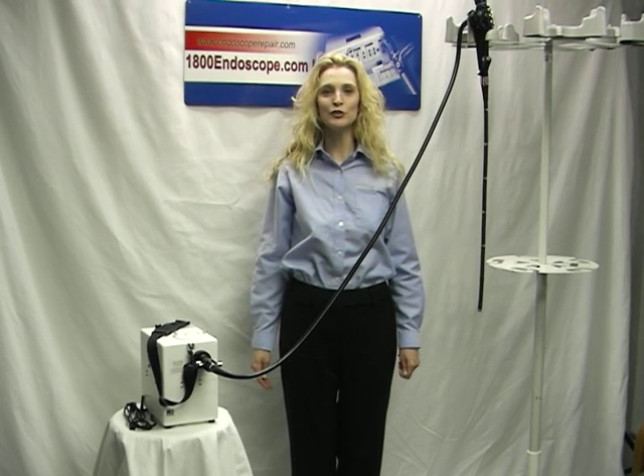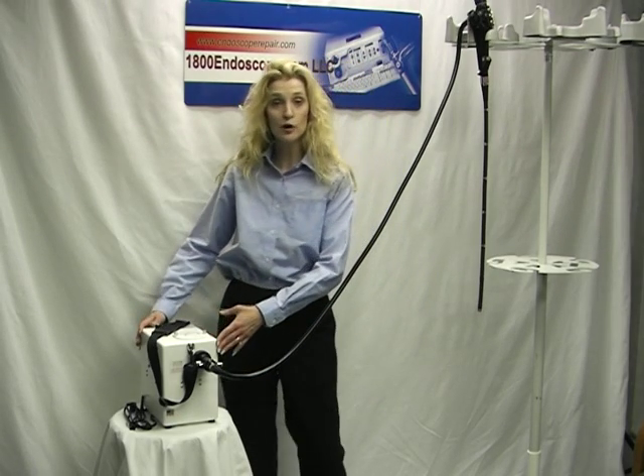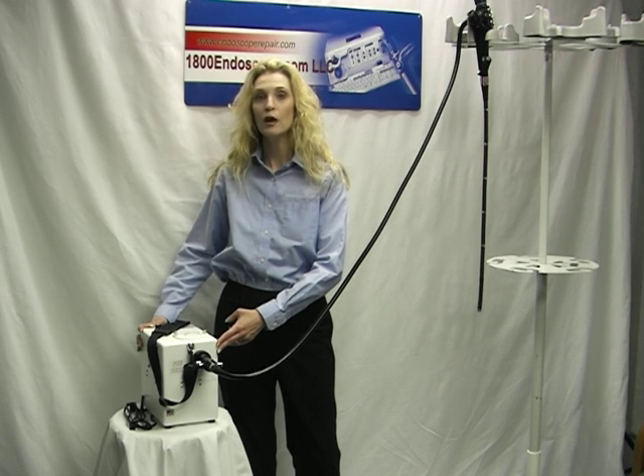Welcome to 1-800-Endoscope.com. Here we have the 1-800-LSP Portable Battery Operated Light Source, great for veterinary or industrial purposes.